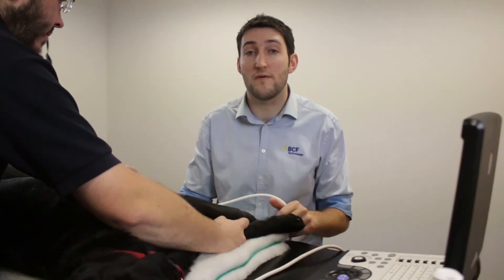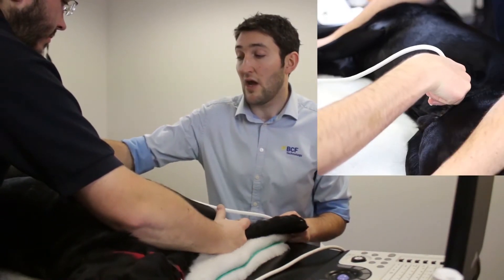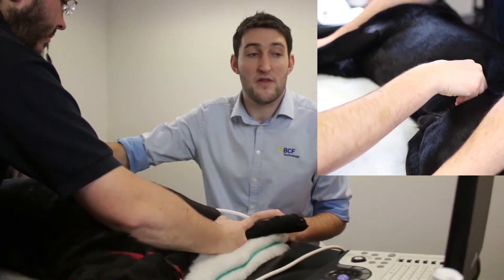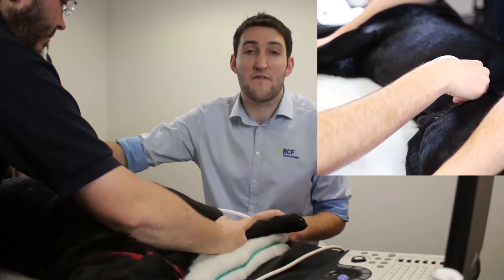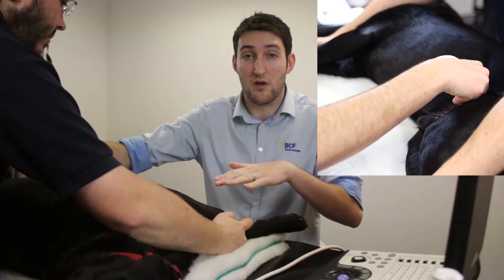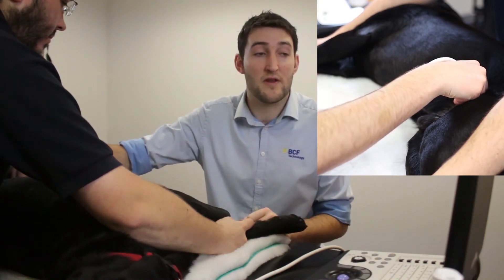From the left flank position we're then going to head to the midline caudally over the bladder, known as the cysticolic view. We're just going to basically come from above, so we're looking down towards the table. The idea being that the fluid, if there is any, will under the effect of gravity have sunk to the dependent side.